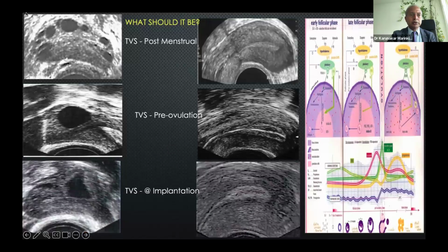Ultrasound is a very good indicator of endocrinology. In the mid-cycle, if you scan her, you see a dominant follicle, you see 8 to 10 antral follicles per ovary, you see a beautiful myometrium and endometrium, and it does confirm the hypothalamo-pituitary-ovarian-uterine axis for sure. If the 3 lines are equal, it's just estrogen. If the outer 2 lines are thicker, there is early luteal phase. If all 3 lines become completely white, the progesterone is at least 12 to 15 nanogram.